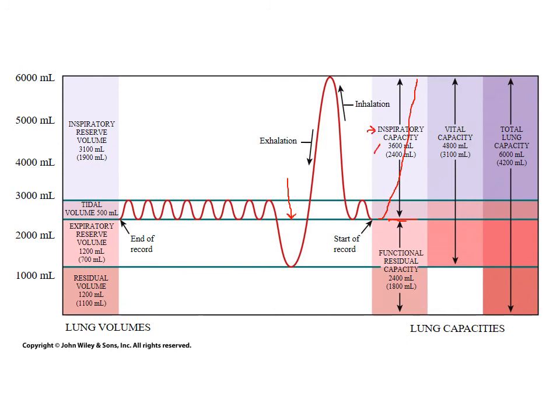Capacity is, again, how much I can do. How much can I breathe in? It's going to count the breathing in of the tidal volume plus the breathing in of my inspiratory reserve. So it is called the inspiratory capacity. The inspiratory capacity is the addition of both the tidal volume plus the inspiratory reserve. Most people get that one pretty well.